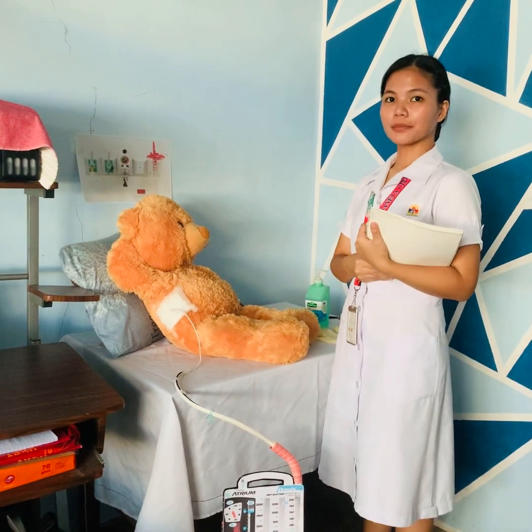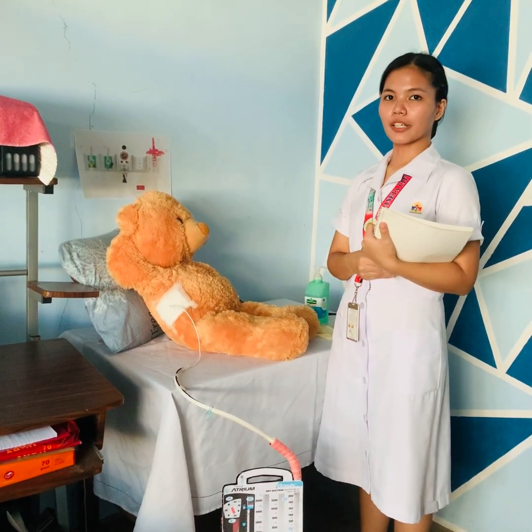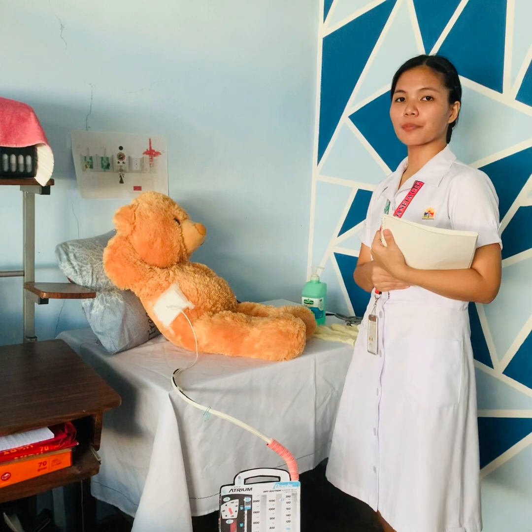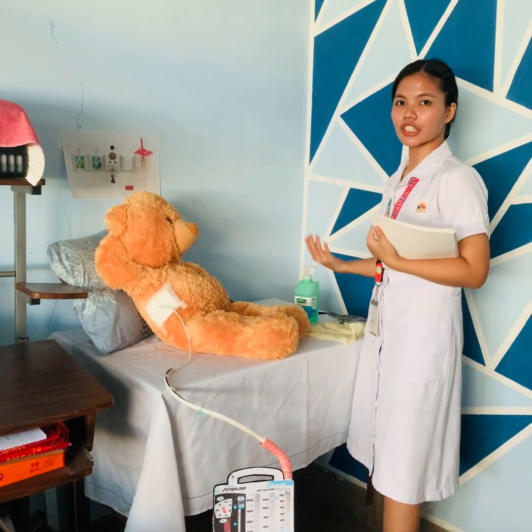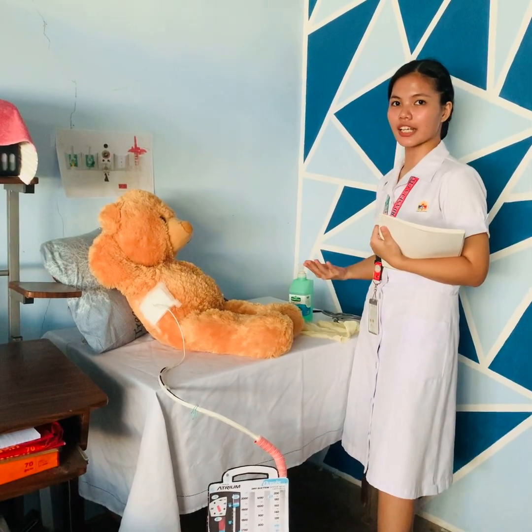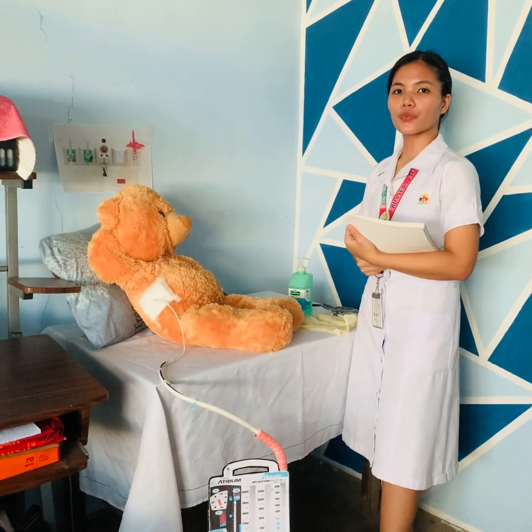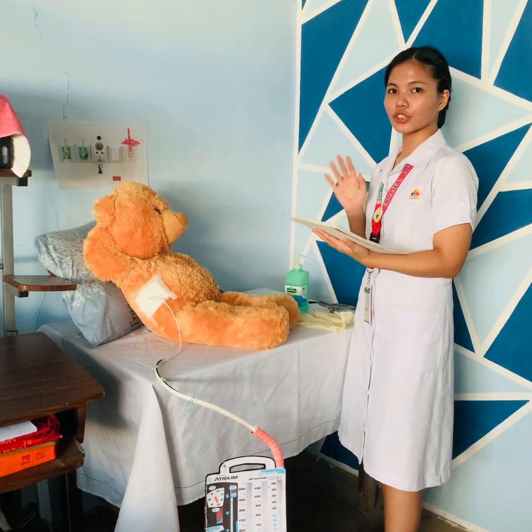Hello, I'm Jermyn Ann Marquez and I will be performing the return demonstration on assessing a chest tube drainage system. First, check the doctor's order.